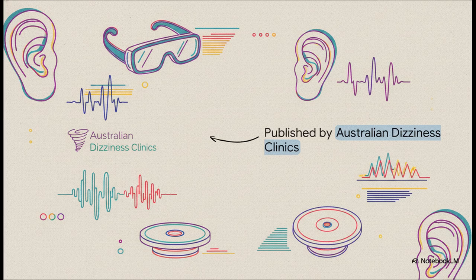Now, when you stack these up with a V-hit, they give you this brilliant, complete frequency map of your patient's vestibular system. But even more crucially, they tell you exactly what speed of head movement you need to be prescribing. So today, we're going to break down these reports, calculate canal paresis, and hopefully help you dodge a few classic clinical traps along the way.